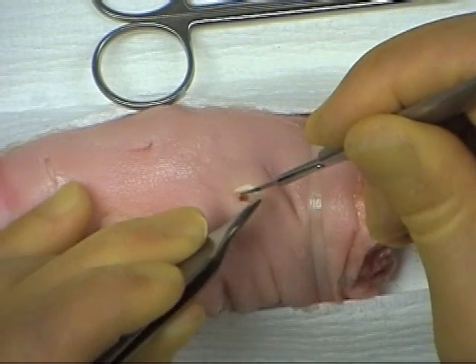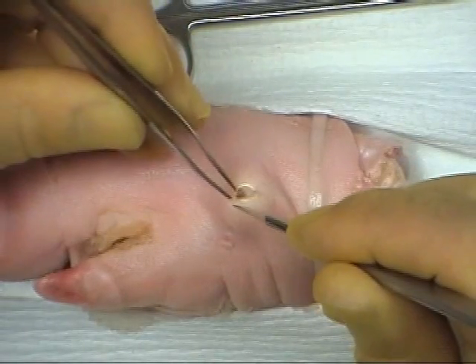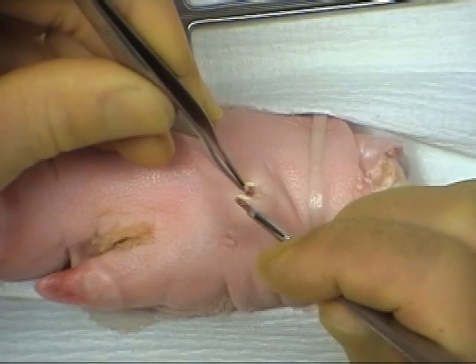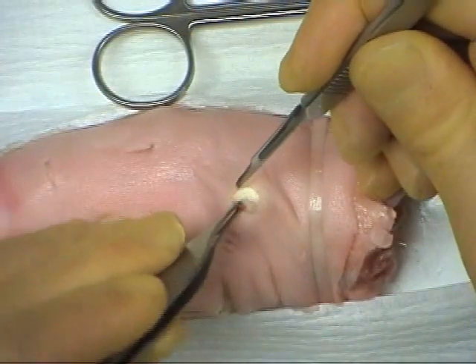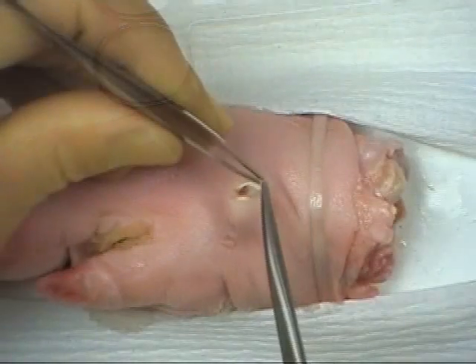The edge of the incision must be in a clean V-shape, and care must be taken not to puncture the cyst during dissection. The ellipse is almost completed and the punctum left in situ as the dissection continues.